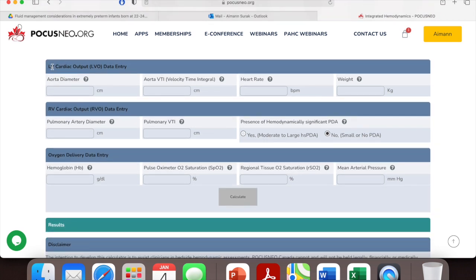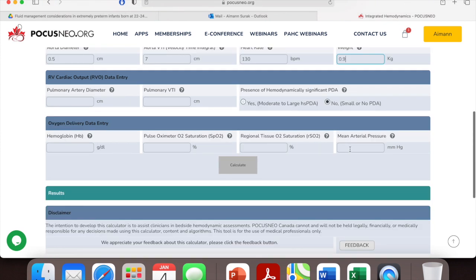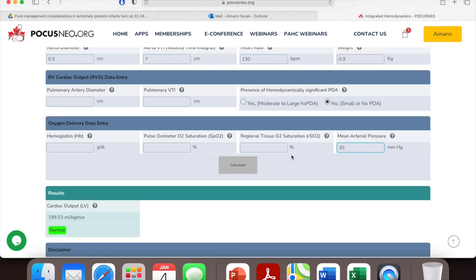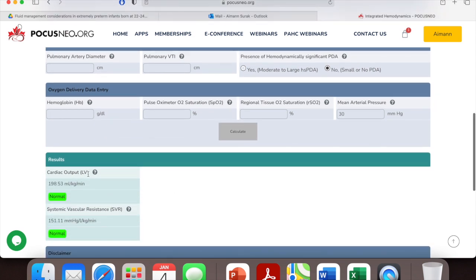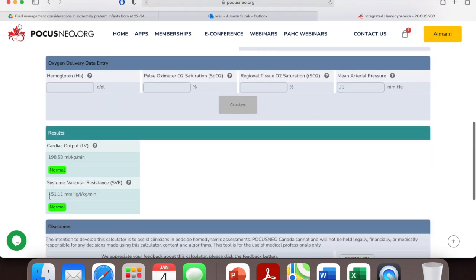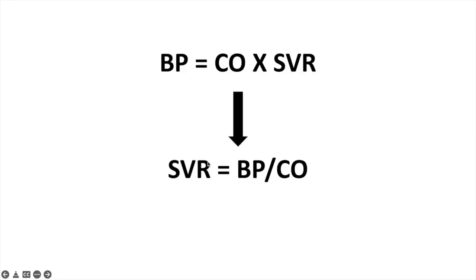Basically it's asking you to enter parameters for left ventricular cardiac output — as we discussed before, the aortic diameter and the weight of the baby, let's say 0.9 kg. To refresh your memory, I posted a previous video about how to calculate left ventricular output. The other parameter you need is the mean blood pressure — let's say 30. When you hit calculate, it gives you the left ventricular output and then the systemic vascular resistance as a number. This is how we come up with the SVR.